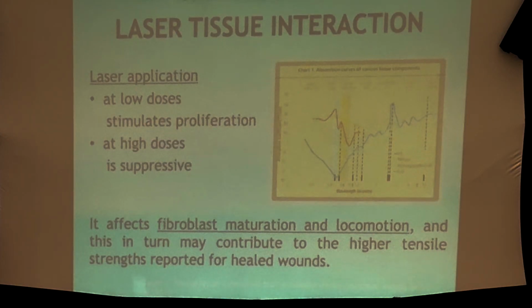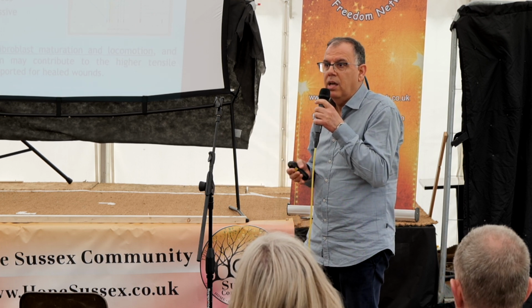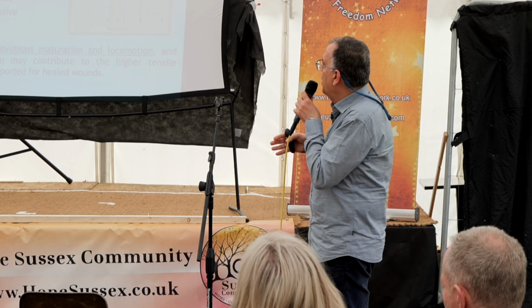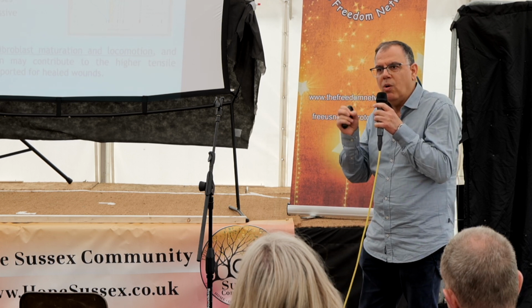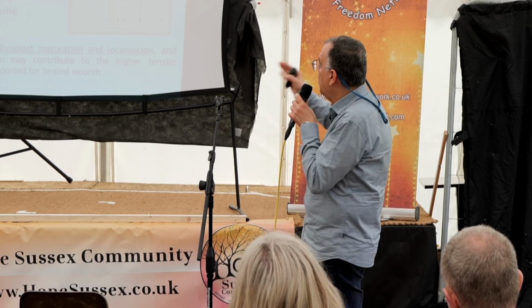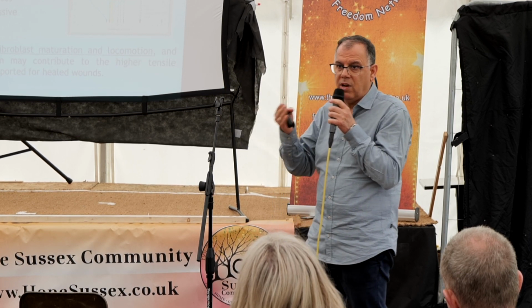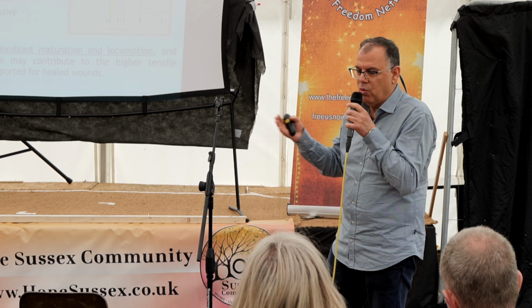So at low doses, as I said, it is stimulating. This is the only tool, in comparison to other tools we use in holistic dentistry, like ozone or electrotomes. But electrotomes are really destructive and suppressive, and ozone has very limited uses in dentistry. It could help only in remineralization of very small cavities, and it could help in gum disease, but many studies indicate that low-level laser application and therapy is far more superior and effective than ozone treatment. I'm not disparaging ozone or my colleagues who are using ozone.